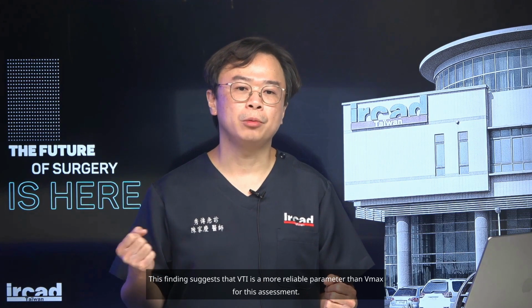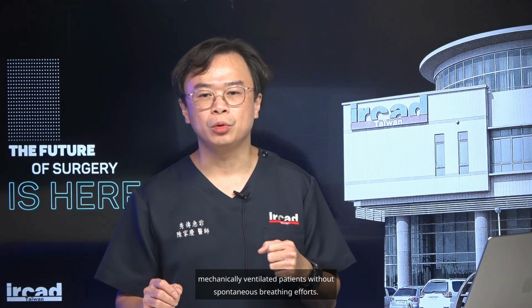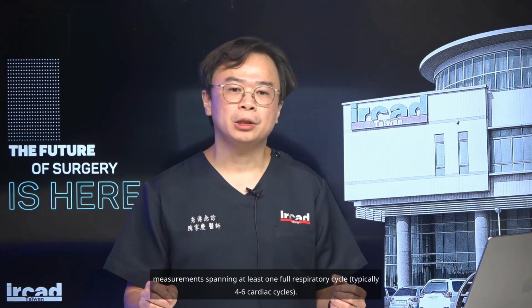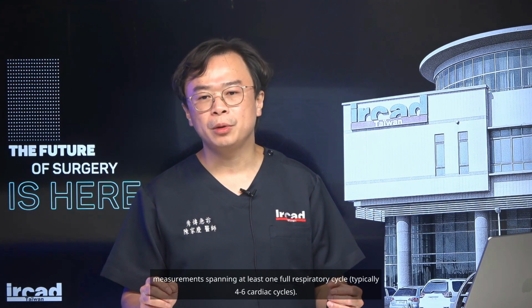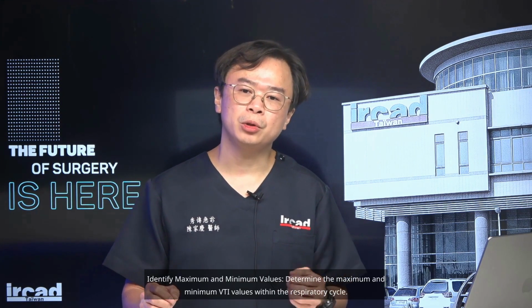Respiratory variation in LVOT VTI. Respiratory variation in LVOT VTI offers another dynamic assessment of fluid responsiveness, particularly useful in mechanically ventilated patients without spontaneous breathing efforts. Measuring respiratory variation: 1. Record multiple cardiac cycles. Obtain continuous LVOT VTI measurements spanning at least one full respiratory cycle, typically 4-6 cardiac cycles. 2. Identify maximum and minimum values. Determine the maximum and minimum VTI values within the respiratory cycle.